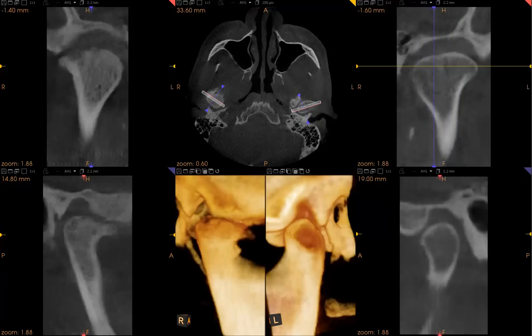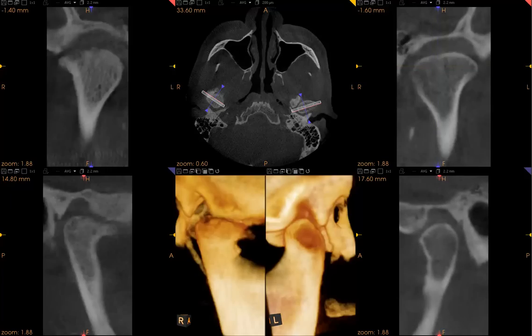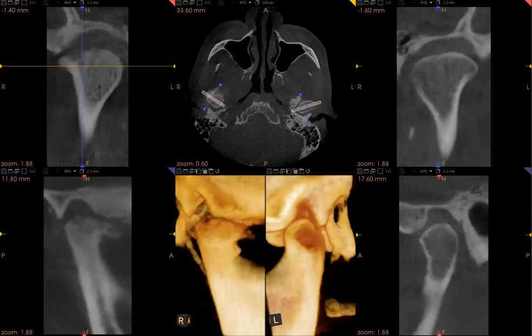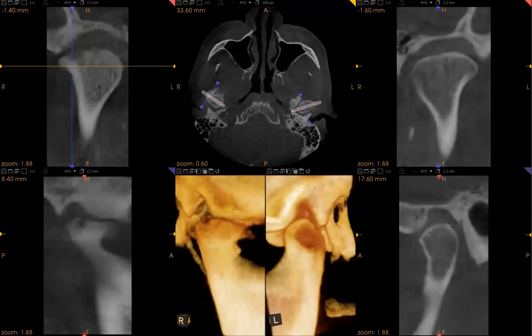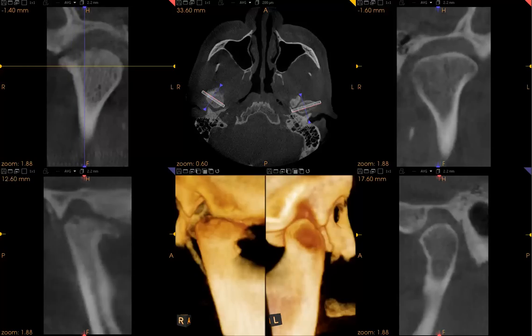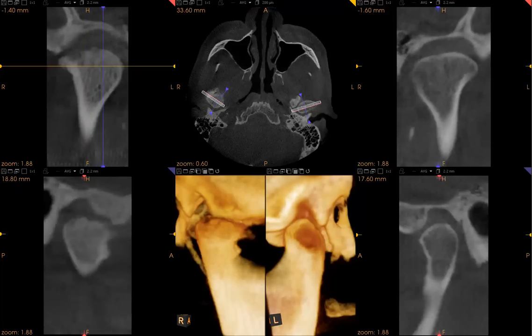In contrast, when we go to the other joint — the right joint — we can see that as we progress from the center of the joint towards the lateral pole, we lose contour integrity of the surface of the condyle, and we create that beaking effect towards the frontal part of the joint. Although the medial pole does have some cortical integrity, it still has little breaks in the cortex.